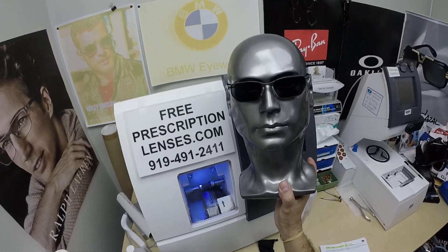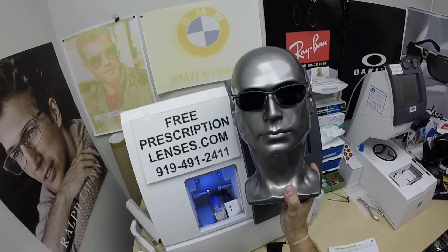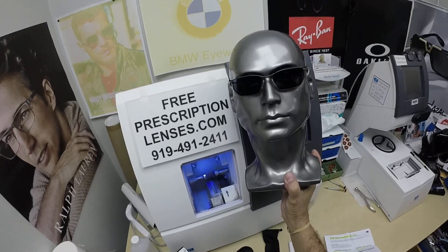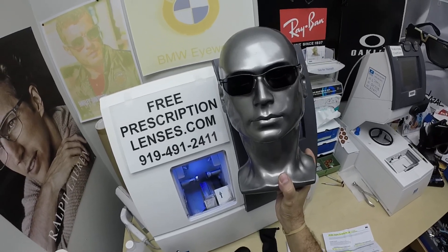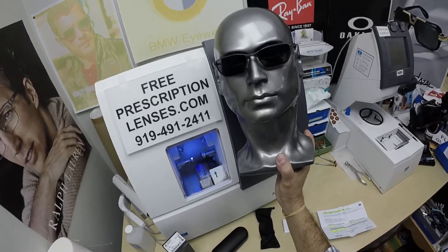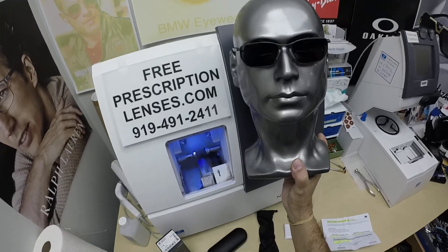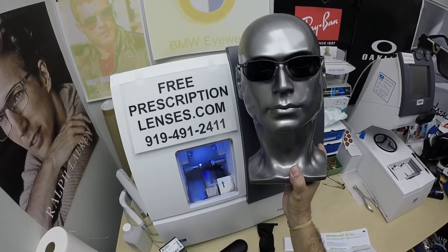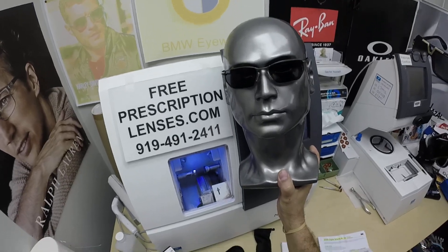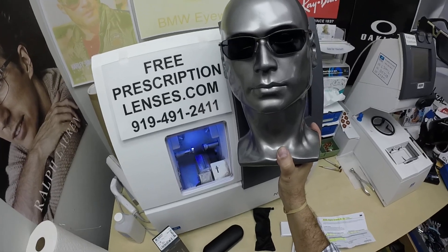Nobody or nothing works 100% when it's 100 degrees outside — we all work much better when it cools off. There is the Photofusion Extra Gray, designed for extra active people who spend extra amounts of time outside, and they will get darker in hotter weather. These will get as dark as the extra dark gray, but they turn back even faster. The extra dark will get 50% dark behind a windshield, where these will only get 30%.